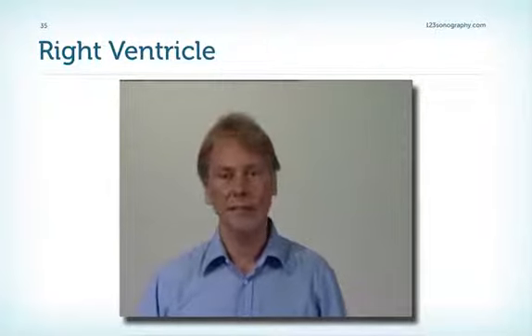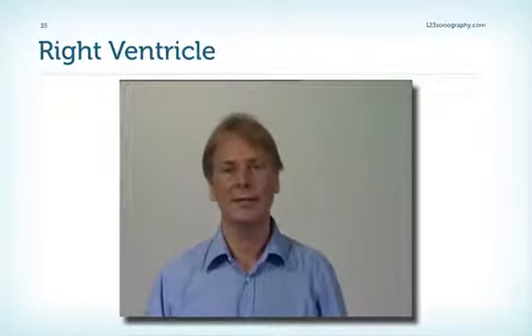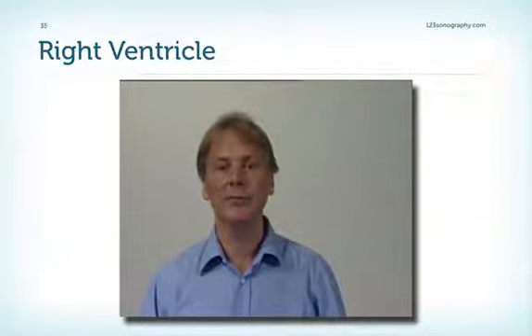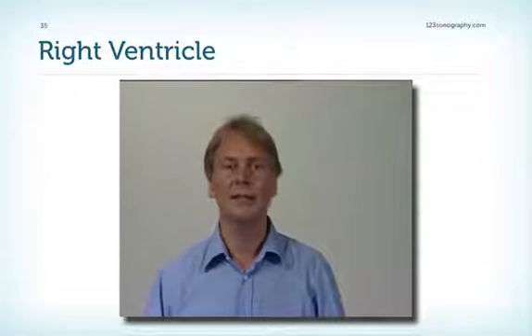I believe this information will provide you with a basic armamentarium to allow you to assess the right ventricle. However, be aware that there's a number of developments which are now being tested which could help you in the future, such as speckle tracking or 3D echocardiography.